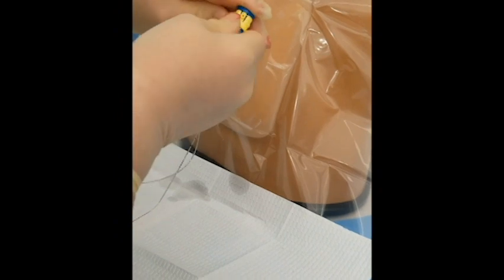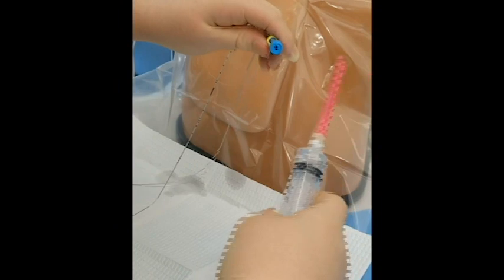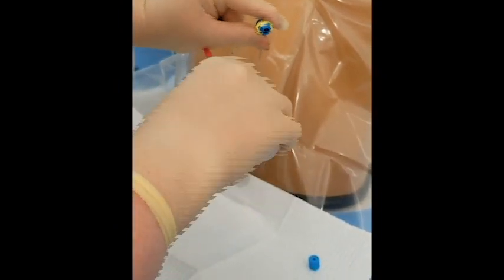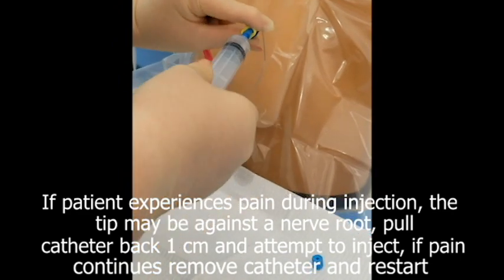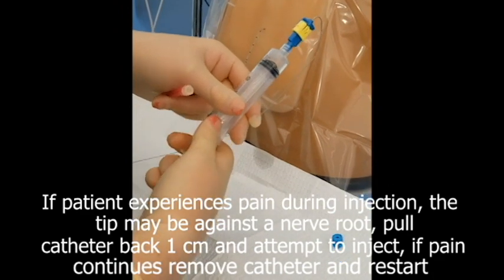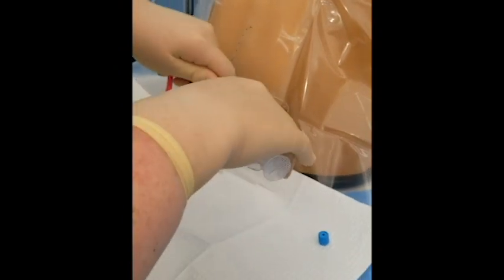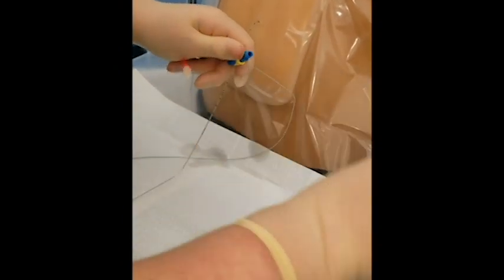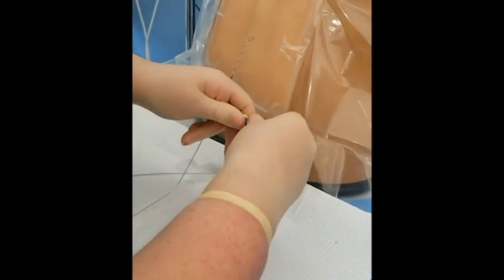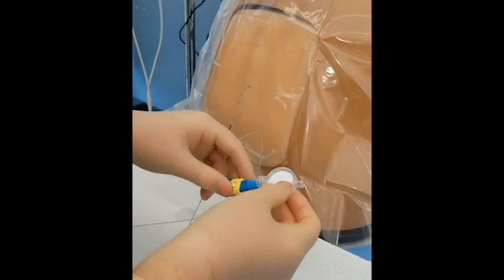Get your test dose attached to the syringe. Always aspirate before injecting an epidural catheter. Check for blood or CSF. If both are negative, go ahead and inject your test dose and notify the nurse that you are injecting this. If the patient suddenly starts to feel numb in their legs or has an increase in their heart rate of 30 beats per minute or more, you may be in a vessel or you may be in spinal fluid.